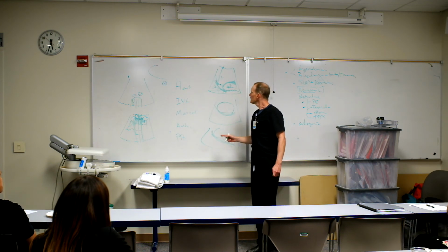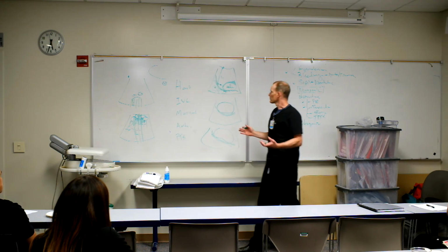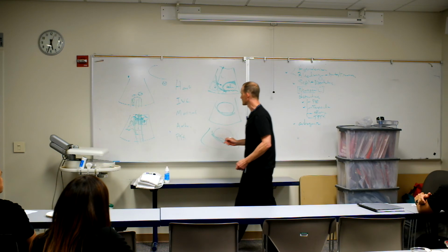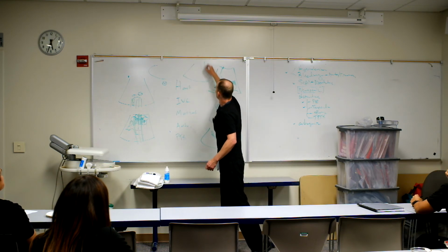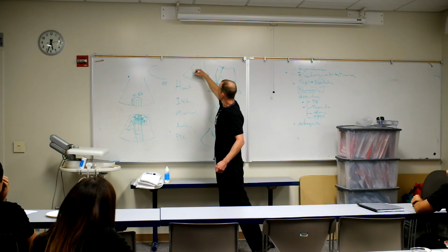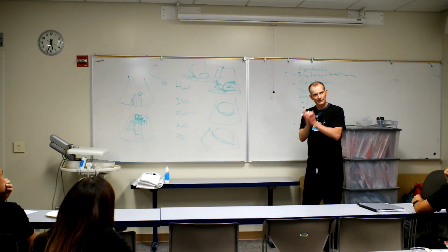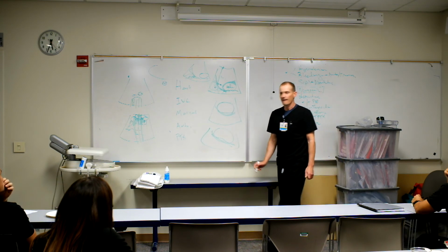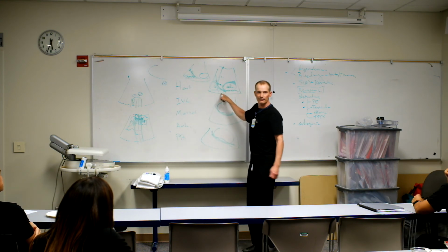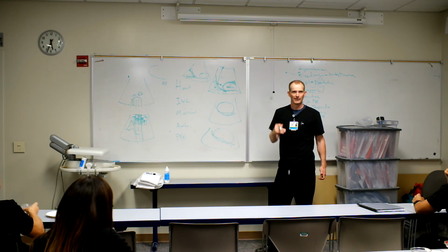Okay, so if there's a consolidation or a socked-in pneumonia or atelectasis, or an effusion squishing things or whatever, you actually will see the lung in here, and it'll kind of look like this. Spine comes across, and you may have fluid here and a little jellyfish thing floating around in there, and that's an atelectatic lung. It's not filled with air. Okay? So every now and then you won't see the fluid, but when you see that spine go past that diaphragm, then that's actually lung you're transmitting through, and that's not lung filled with air. Okay?